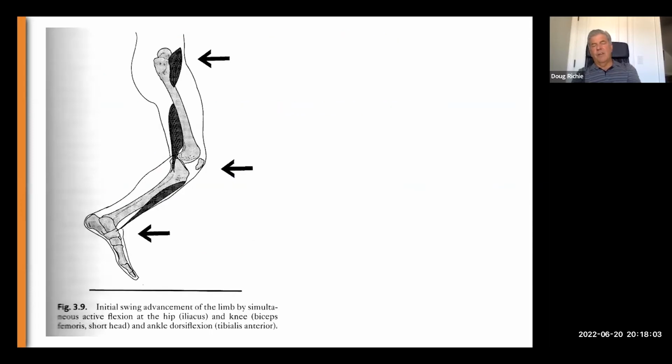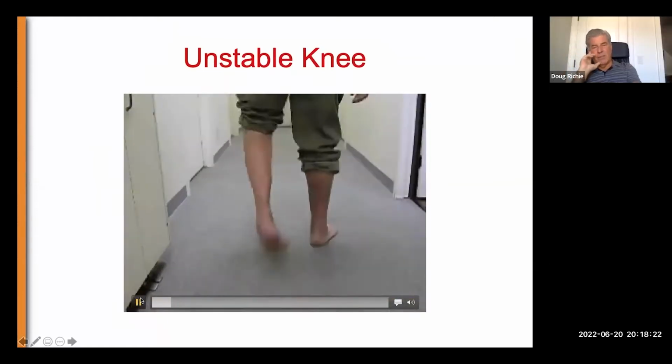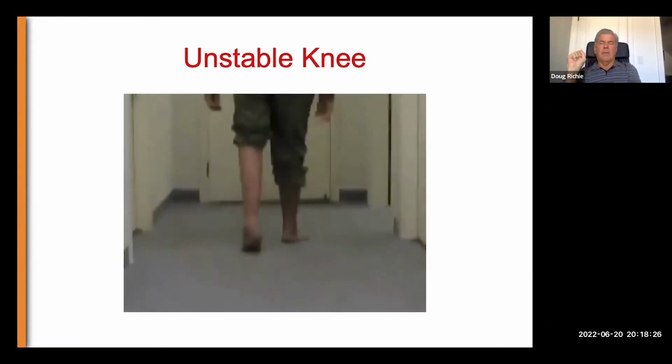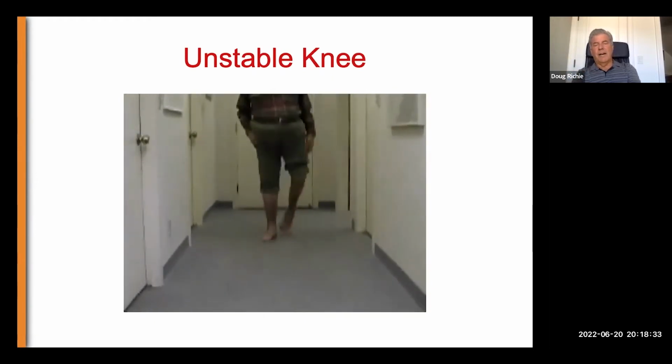So when we see a child walking with a crouched gait, such as a child with muscular dystrophy, and the knee is excessively flexed, we need a solid AFO to straighten that knee. Most Richie braces will not address that situation. This is a patient who has another form of unstable knee. It's a polio patient going into severe recurvatum. Again, the desirable brace here would be a more solid brace to push the tibia forward and push the tibia out of recurvatum.